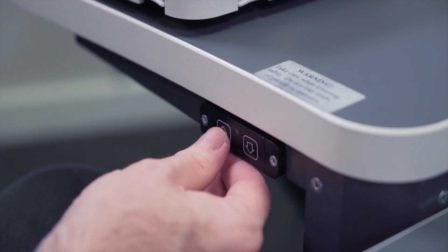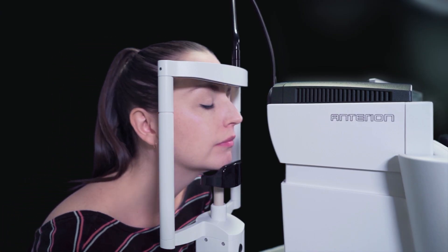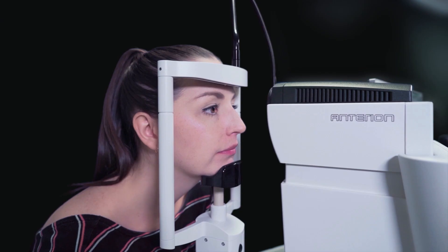You can adjust the height of the table for the patient. Adjust the chin rest to align the patient's eyes with the marks on the headrest column.